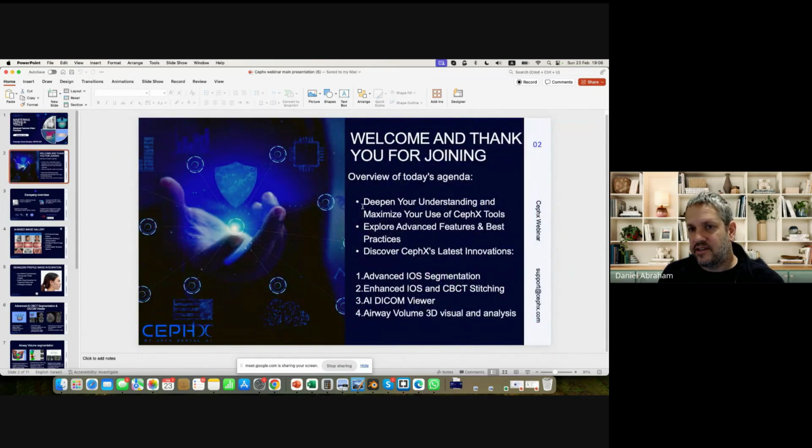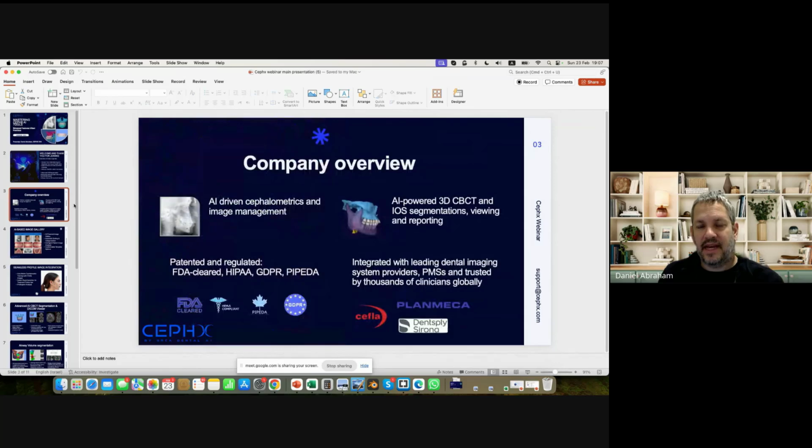So we're here to deepen your understanding and maximize your use of CephX tools, explore the advanced features and best practices, and discover our latest innovations, both on 2D and 3D. I think there's a lot of relevant stuff here. And a little bit about the company.